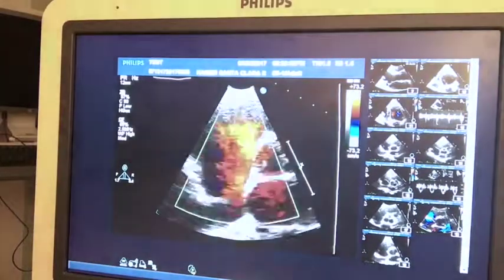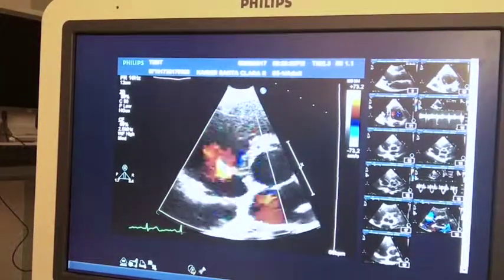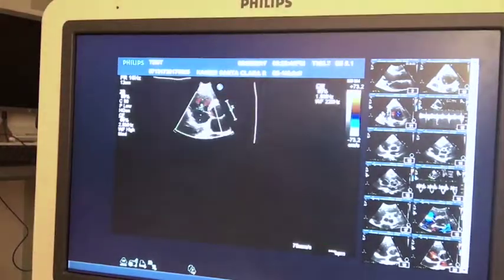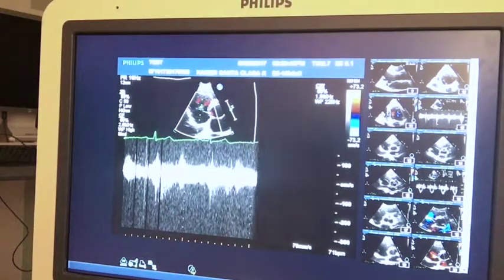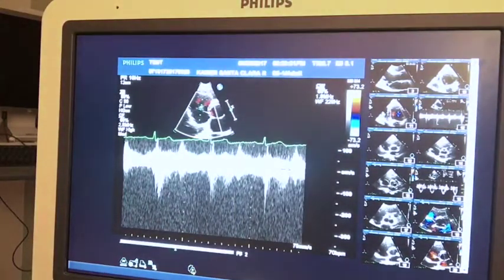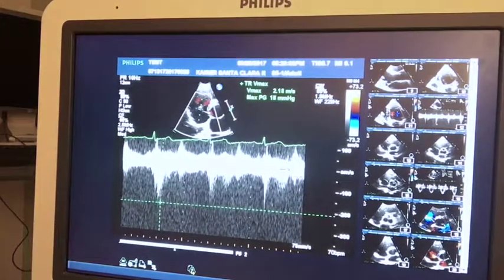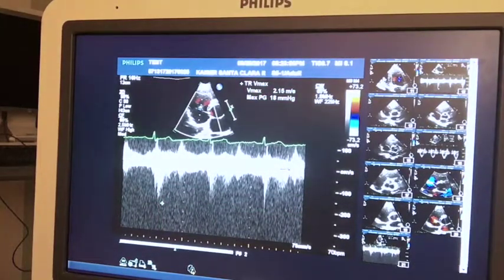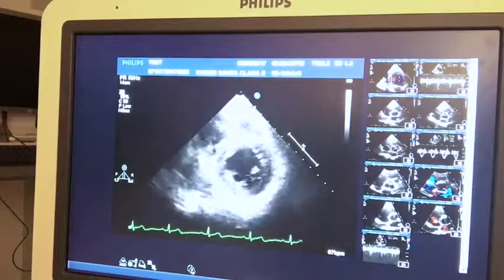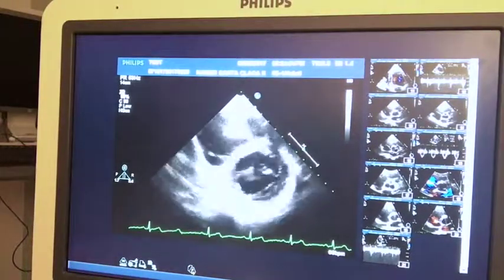Then I'm going to go to the tricuspid, or move across the screen to the left side of the screen, or the right heart, and show again that wispy, tiny little bit of tricuspid regurgitation that's hardly there. My numbers, I can still get my numbers. It's going to be around 18, but that's not a complete envelope really. Maybe able to get a little bit better when I get to the apical long views.